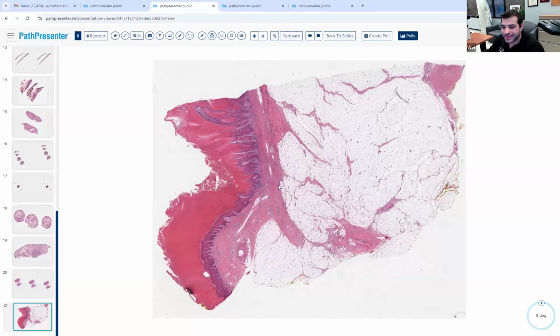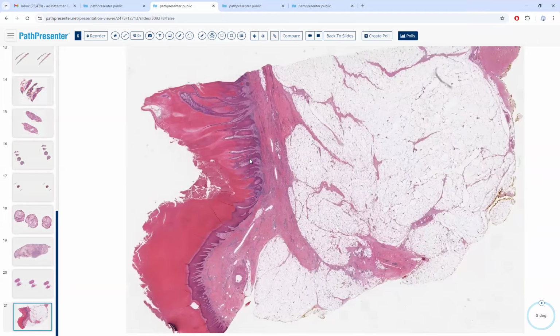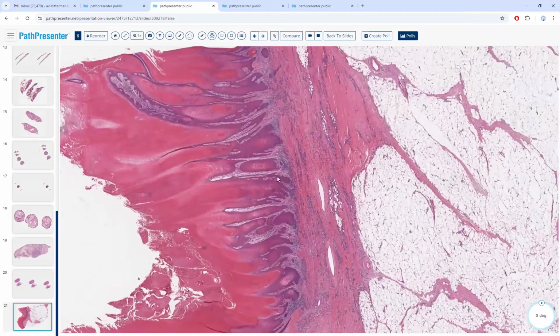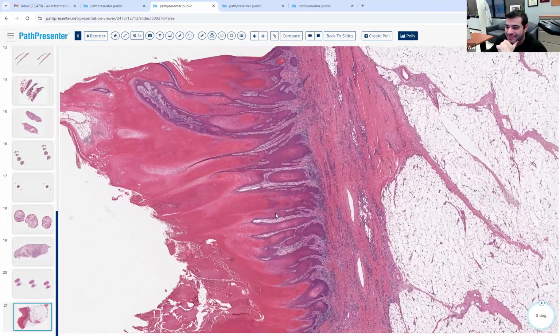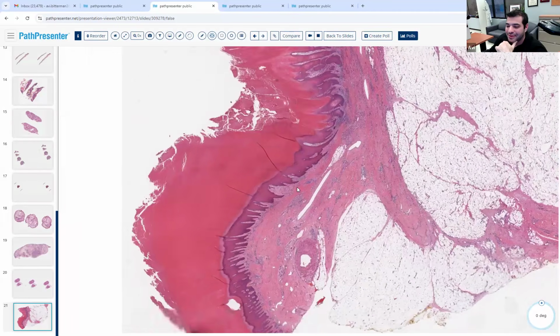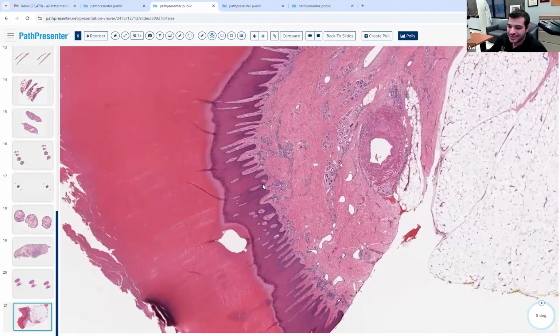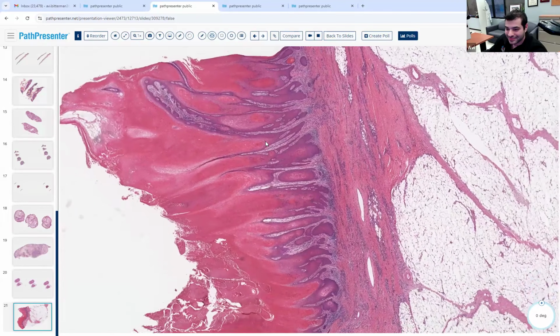So where is this biopsy from? Volar, yeah, stratum lucidum. Volar skin. What's going on? Well, you can see already where the abnormality is, because this is relatively normal, and this is clearly not normal.